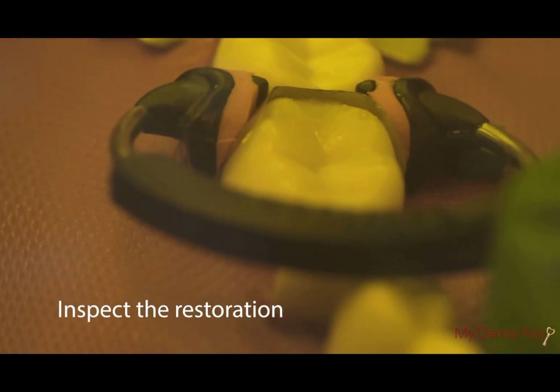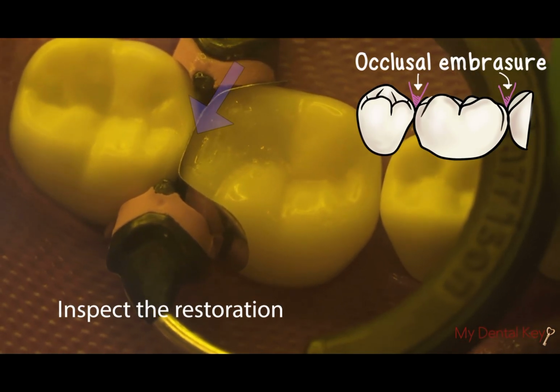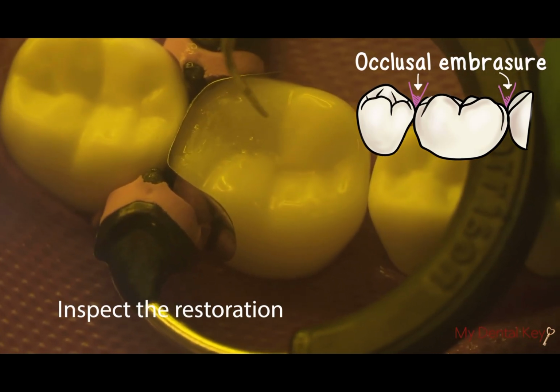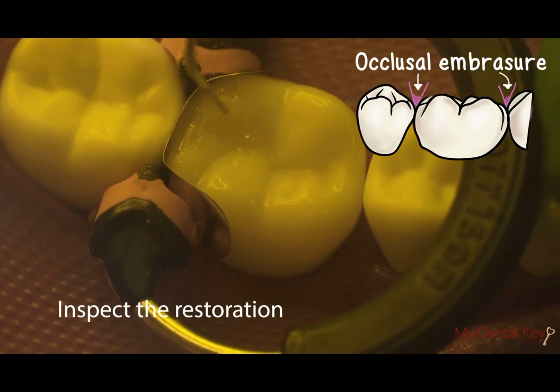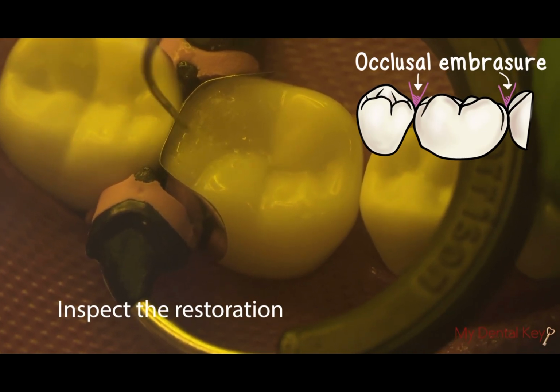Before removing the 3D ring setup, it can be very helpful to inspect your restoration and make sure you're satisfied with the marginal ridge area. Make sure you've recreated the occlusal embrasure and that the marginal ridge is approximately the height of the adjacent tooth's marginal ridge and matches the marginal ridge areas remaining from the tooth structure that is unprepared.